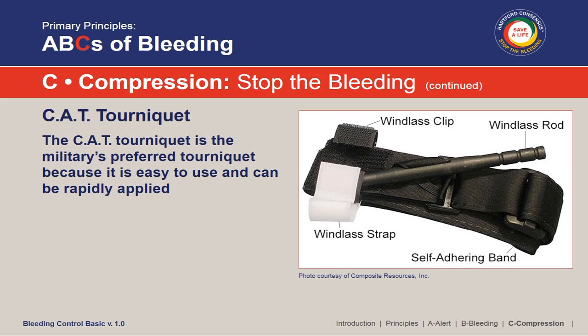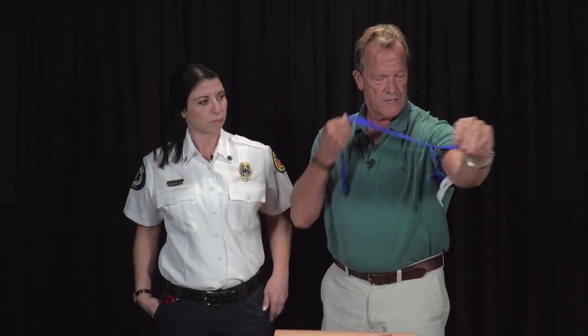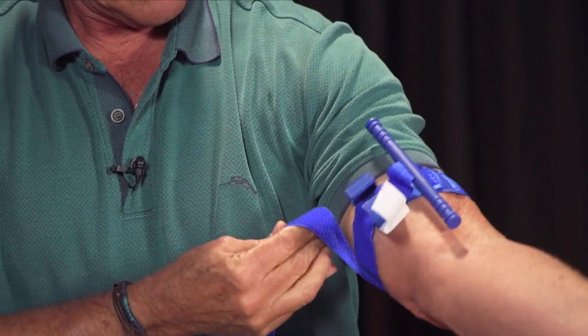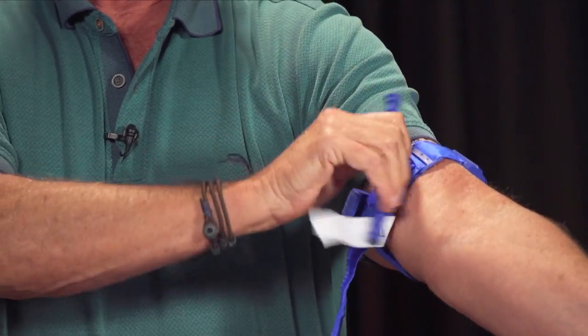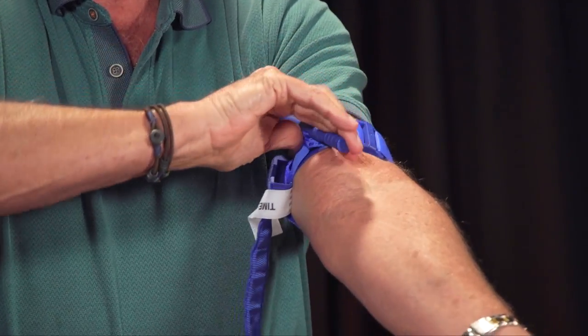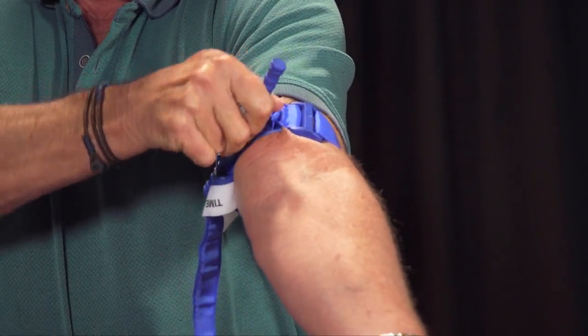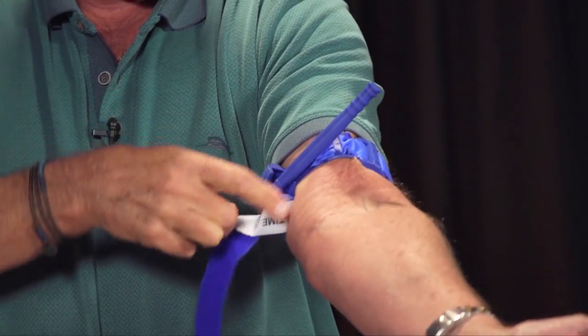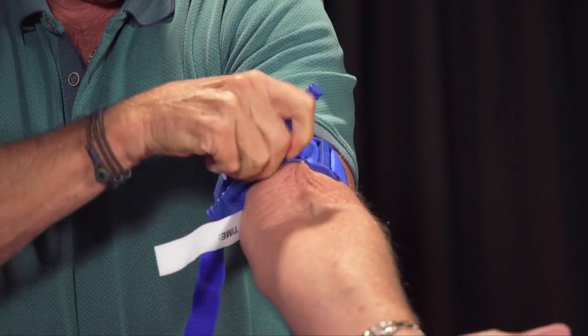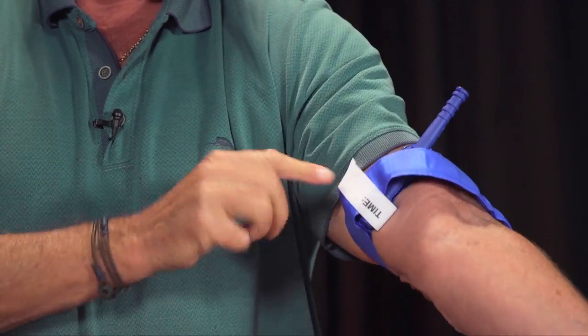With the CAT tourniquet, you can actually apply it to yourself with one hand — this is one of the main reasons it's used by the military. Soldiers can apply it to themselves. You loop it on, twist the windlass until the bleeding stops — that's the key — then lock it into place, get the slack out, put the securing strap over, and write the time down.